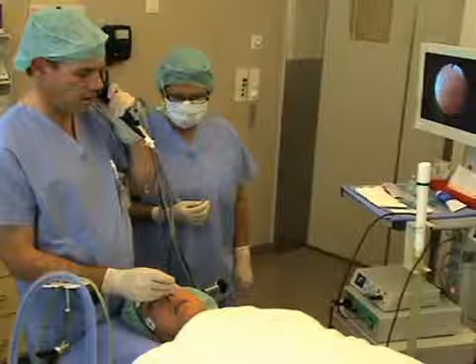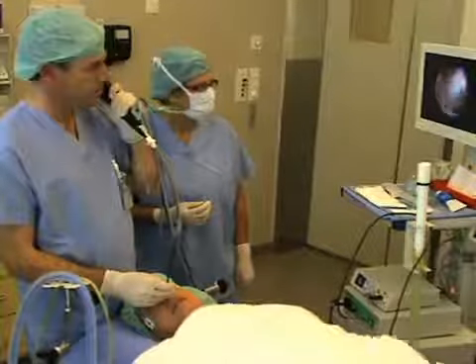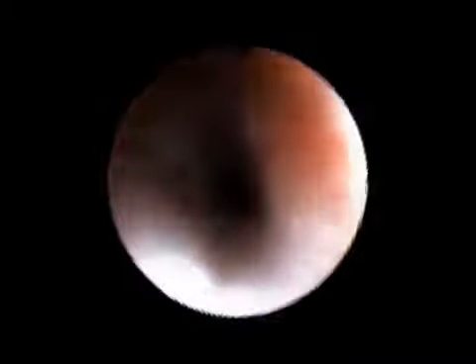You can facilitate the advancement through the glottis by making a slight downward movement with the tip of the fibroscope. Understanding the difference between the trachea with its rings and its posterior tracheal membrane and the esophagus is important because sometimes the scope is unintentionally advanced into the esophagus.